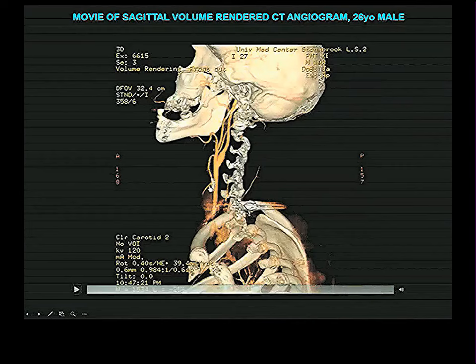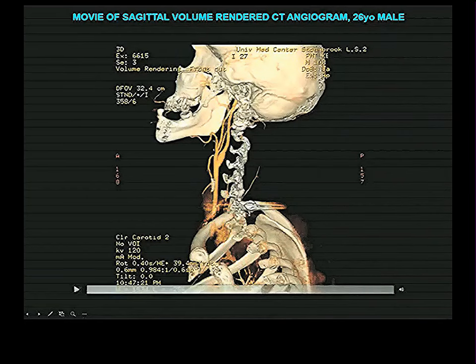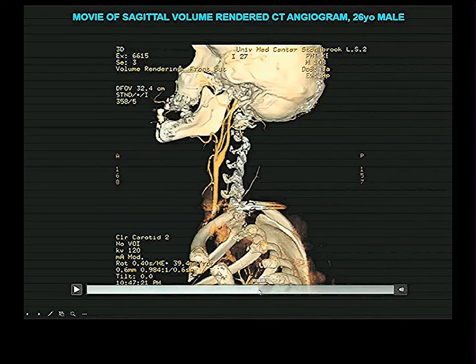This vessel coming down, what's that? Right, superior thyroid. First branch, anteriorly directed branch of the external carotid. We come up, we see a branch coming forward, and let's look at this branch, which is the second anterior branch of the external carotid, because this is a little anomaly, a little variation.